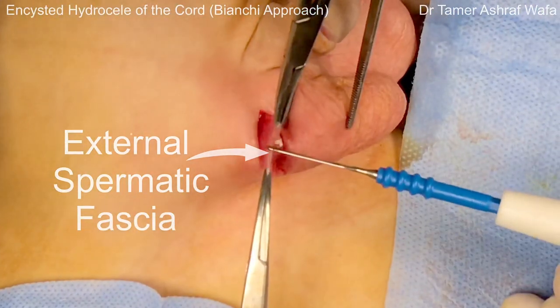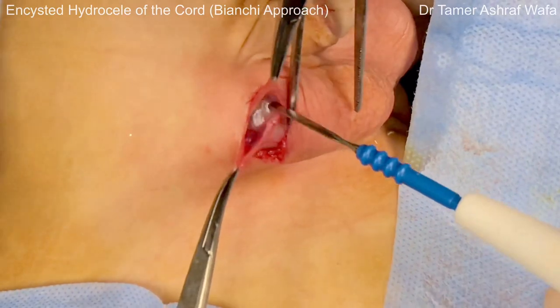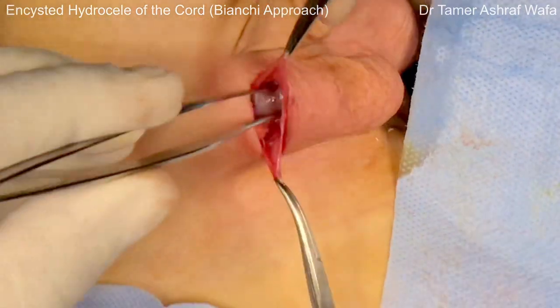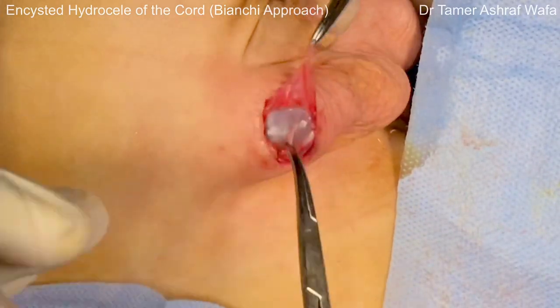The external spermatic fascia is incised longitudinally between two mosquitoes. The cremastric fascia is split bluntly, exposing the internal spermatic fascia.